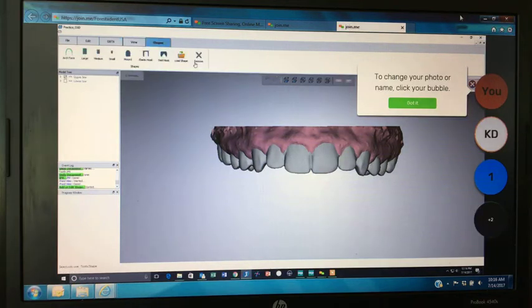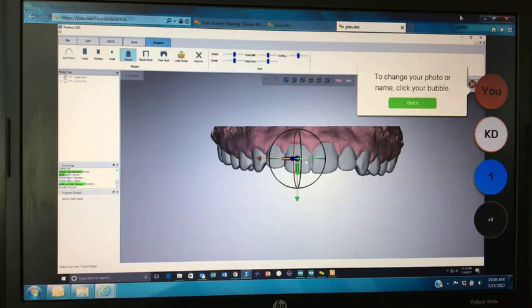There's a menu here that pops up. So we have large, medium, small, mound. There are hooks. You can actually load a shape if you have an STL file. But I'm going to go ahead and click on mound. And then you're going to have that hand tool again. You're just going to click wherever you want that attachment.